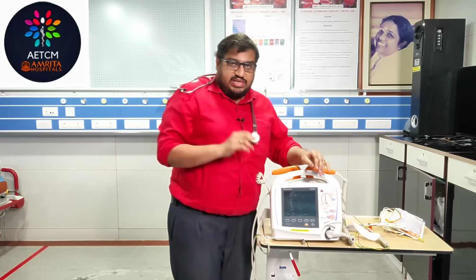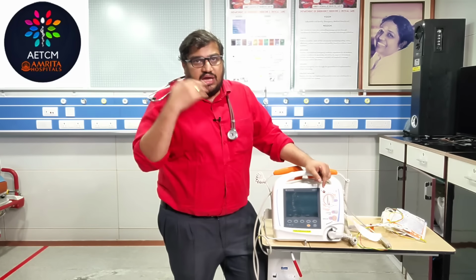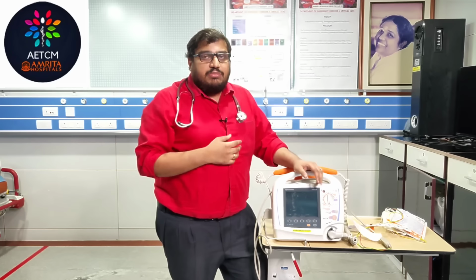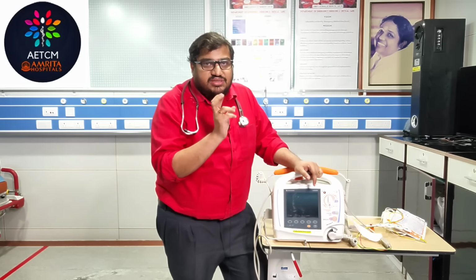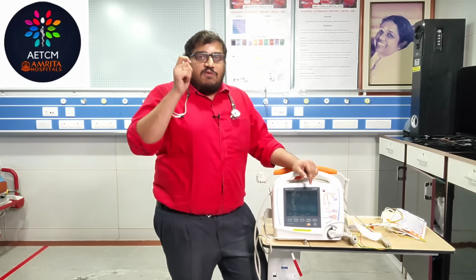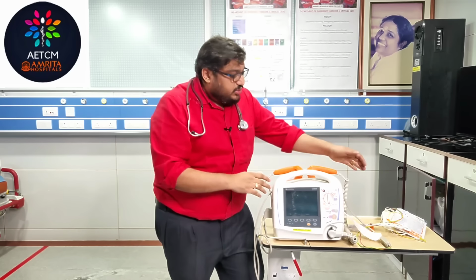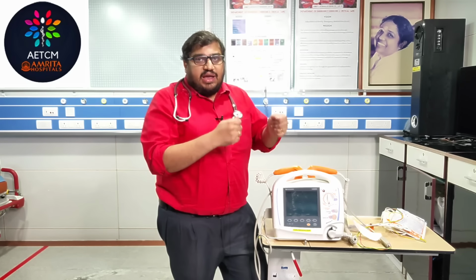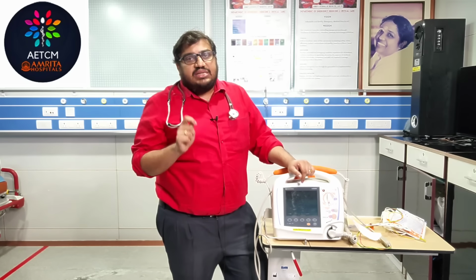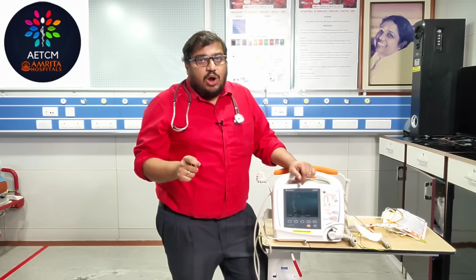Now coming to the procedure. First let's see the defibrillation procedure. We have decided to go ahead with the defibrillation. I am not discussing that because that comes in the cardiac arrest algorithm. So your team leader has decided that this patient needs defibrillation. So what are the steps for defibrillation? First thing is that you have to select the amount of energy, and you have to make sure these paddles are connected, and you apply adequate gel over your paddles. And the next thing that you need to remember is that you need to shout that everybody should be clear, not touching the patient.